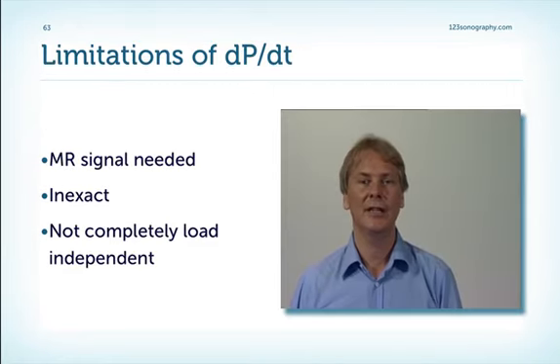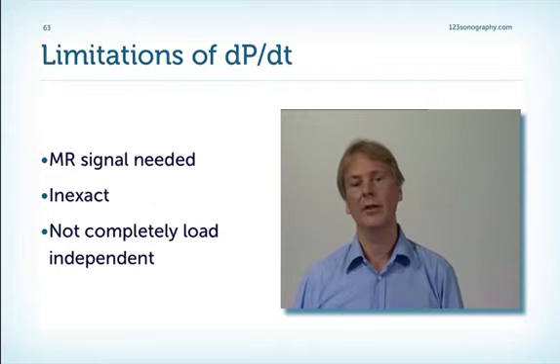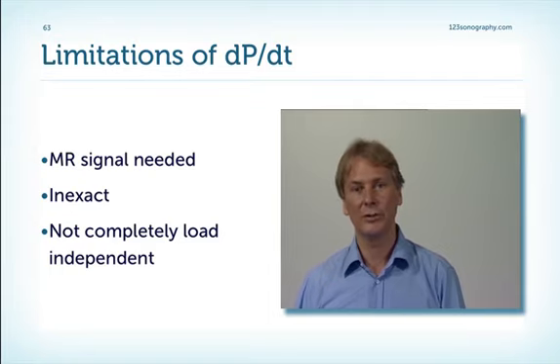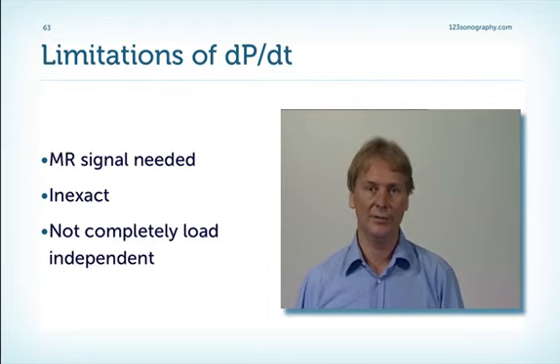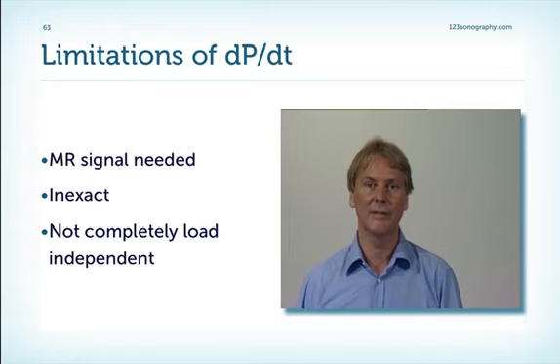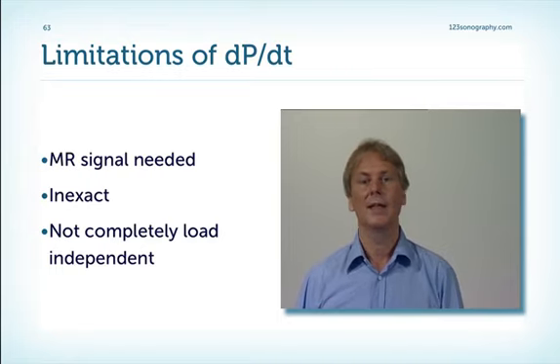Unfortunately, this calculation has a number of limitations. I've already mentioned that you need an MR signal in the first place, and that this signal must be a good signal, especially the initial portions, to perform the calculation. But I still believe that the major limitation is the fact that even small measurement differences make a large difference with respect to the value you get. In addition, it is probably not completely load independent.